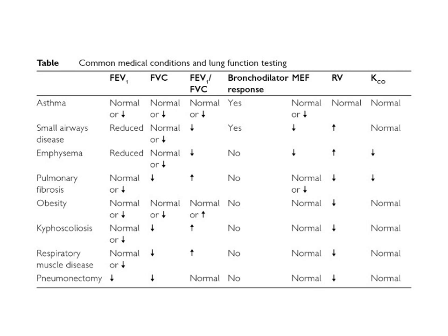Asthma is an obstructive lung disease, and small airway disease and emphysema are also obstructive lung diseases, but you can see here that the parameters are not the same. And by analyzing these parameters and understanding how everything is going on, we can differentiate in medicine between these diseases relying on the parameters of the pulmonary function test.